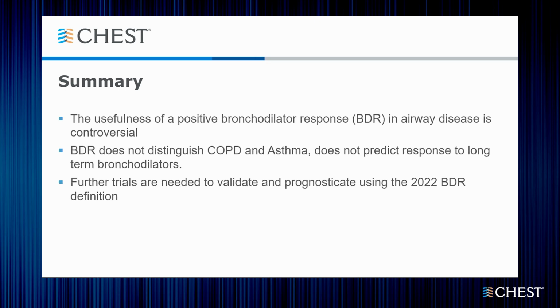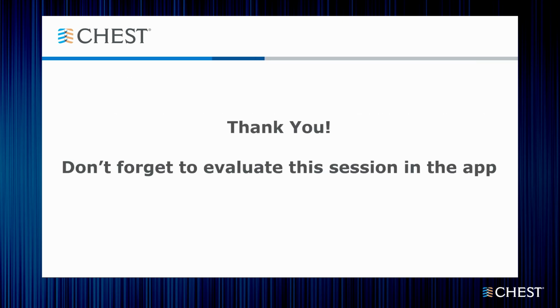So in summary, the usefulness of positive bronchodilator response in airway disease is still controversial. It doesn't distinguish asthma and COPD, we know that. It does not predict long-term bronchodilator response, we know that. But we need future trials to validate and prognosticate and even find the utility of bronchodilator response. With that, I thank you and am happy to take any questions.